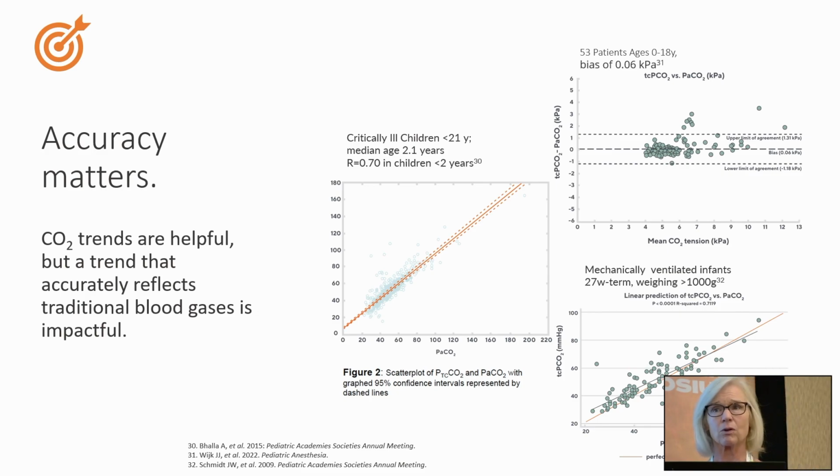So across the board, when used properly, so when you're aware, this is where I'm getting my CO2 sample, I'm making sure that it's well perfused, I'm making sure that there's no pressure on it, I'm making sure that I've made an airtight chamber by using gel. When it's used properly, your accuracy is very good, and you can really trust it to enhance our clinical view of what's going on.